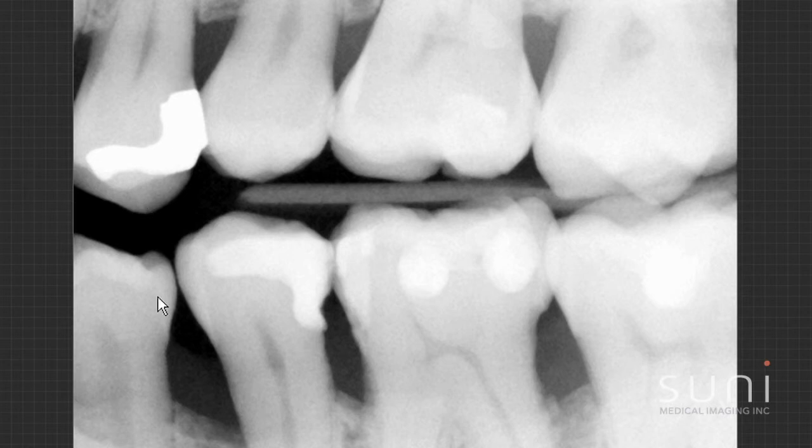He's an older guy. I'm looking for interproximal calculus buildup and I don't see any. With the image quality, I have all the information that I need on traditional bite wings.